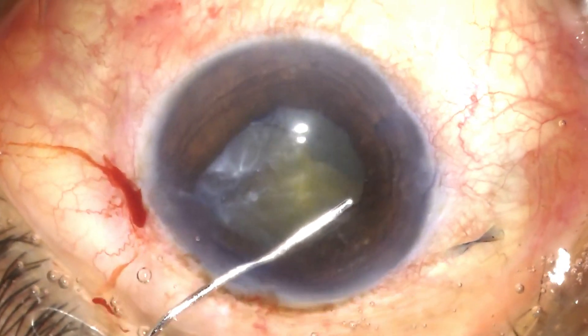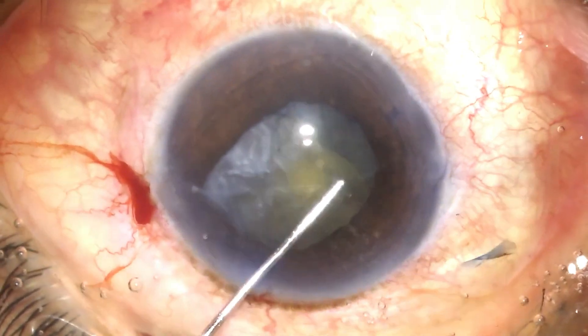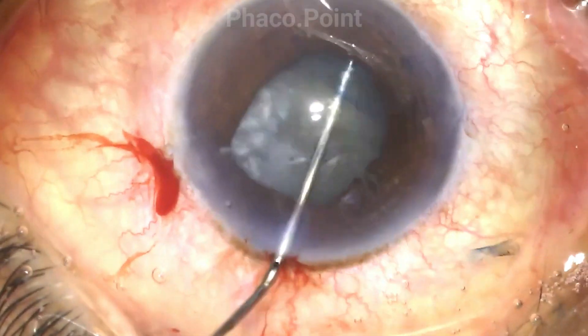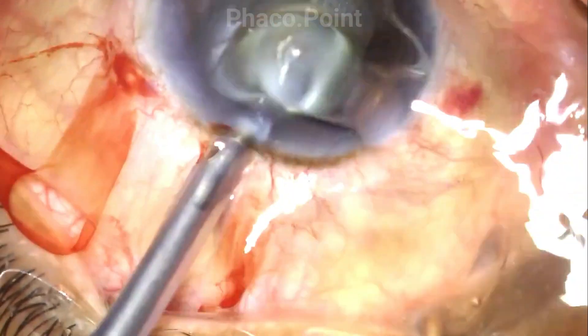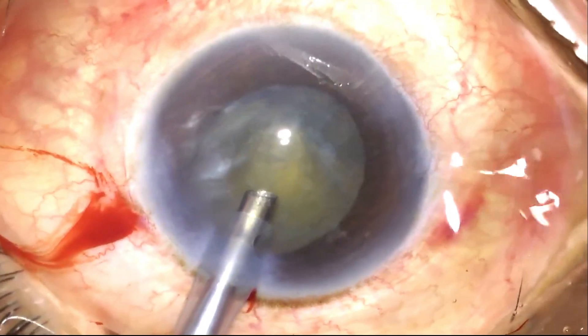Since the capsule is only visible on the right side, I perform a capsular hydrodissection at the 9 o'clock position, look for the nucleus rise, and confirm the rotation of the nucleus. Having completed the hydrodissection, I move now to the nucleus emulsification.